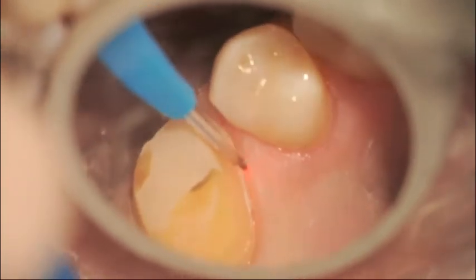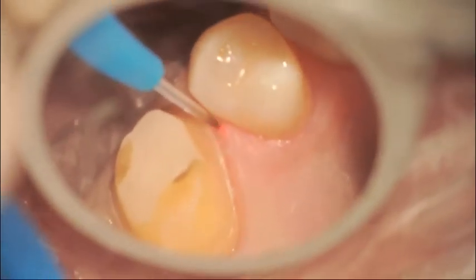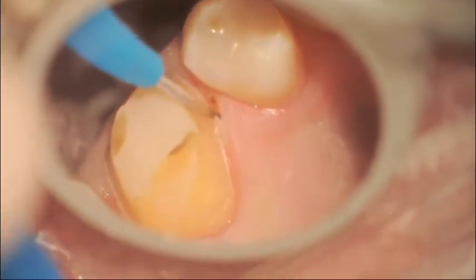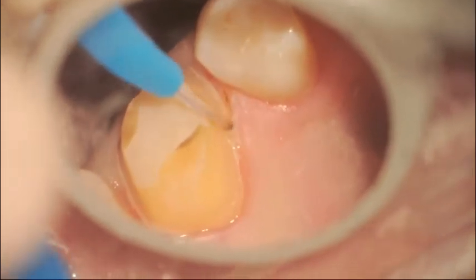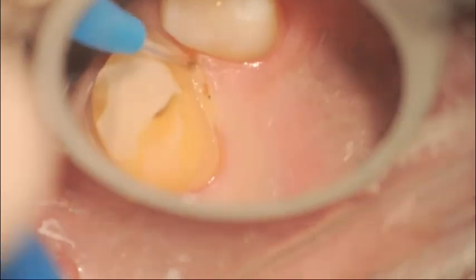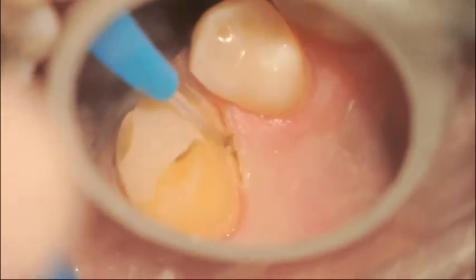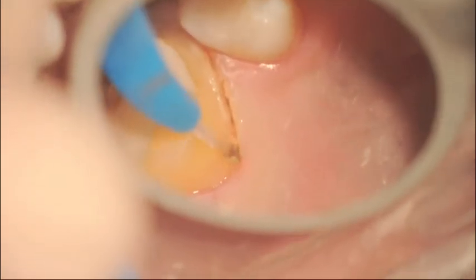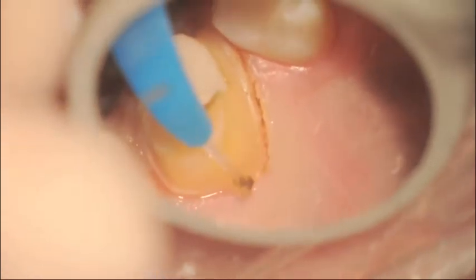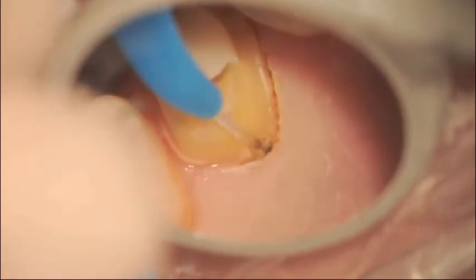We start initiating the tip, and we start crown troughing, going very slightly into the sulcus, moving very slowly with brush-like strokes to gently remove the gingival sulcus. Every time that a little bit of debris piles up on the tip, you stop and use a wet gauze — not alcohol, but just a wet gauze — to remove the debris that gathers onto the tip.